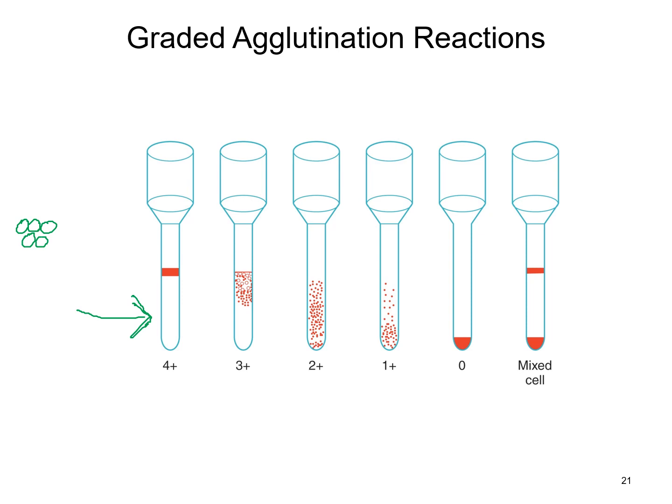So what will actually take place is you will place your patient's serum or plasma into the tube, as well as red cells, depending on if we're using the test red cells or the test reagent, whatever we have to put in this well. Basically, everything goes in here, our antibodies as well as our red cells, whether it's patient or a test reagent. It's going to go into that reaction well. We're going to allow some incubation time, then centrifuge.